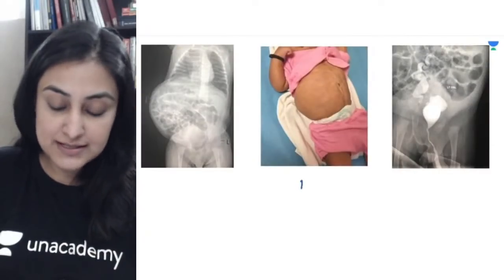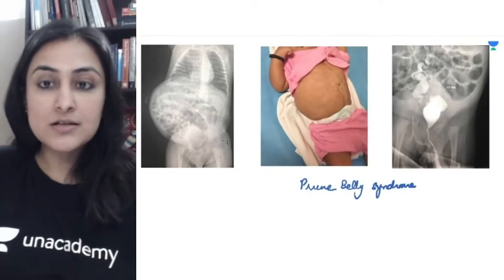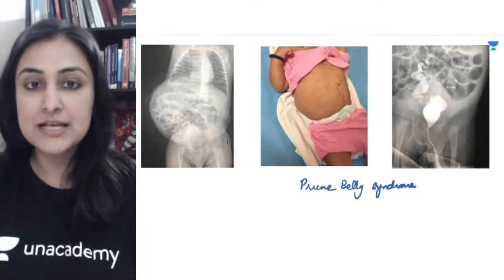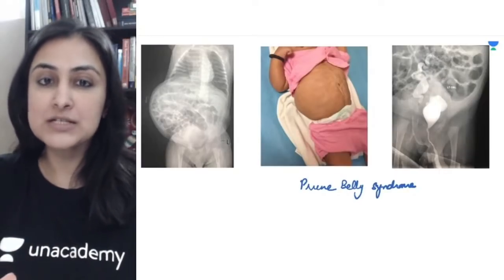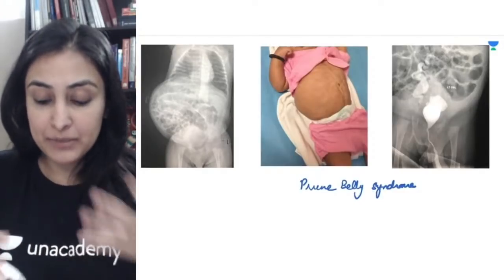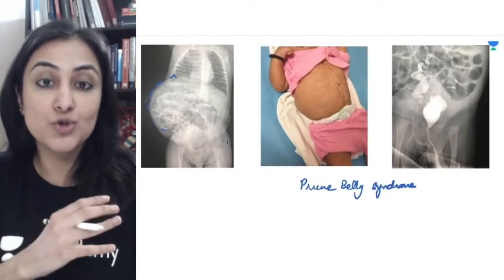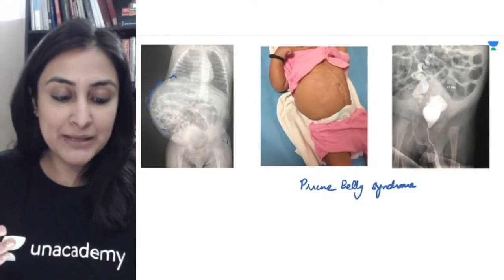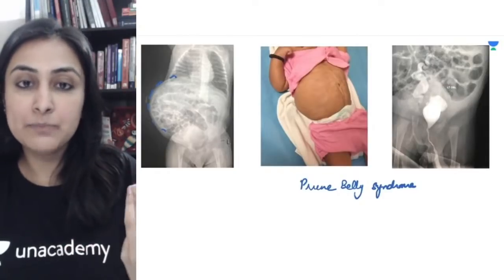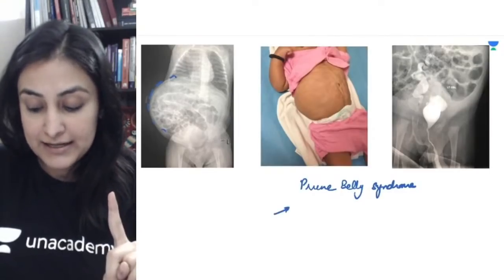This is indeed prune belly syndrome — a very expected image cluster. As the name suggests, there is deficiency of the abdominal muscles. The anterior abdominal wall muscles are deficient, giving this prune-like appearance. On the x-ray, because the muscles are deficient, all the bowel loops are protruding from this weakened skin of the baby.